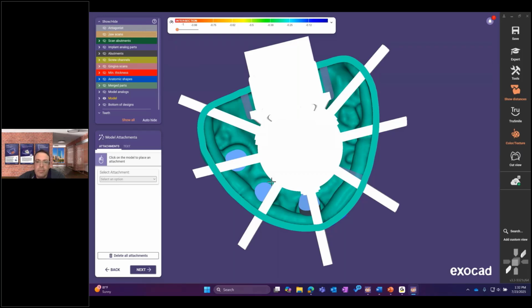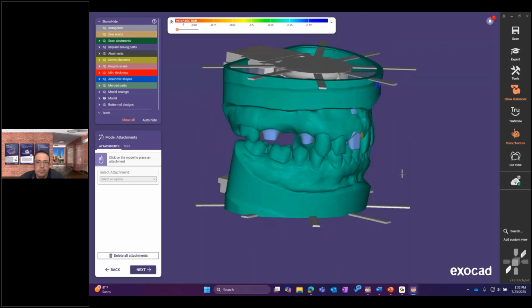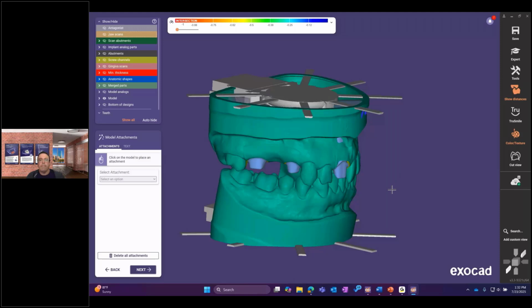And then we got some feedback on some things, and a question about the implant libraries themselves needing updates. So I'll have to follow up on that. I know our integration team's working on updating some stuff on our end. I don't know if the owners, or manufacturers that create the libraries, have any additional tasks on their side as of right now. I've got to double check on that. Yeah, if it's about a specific library, we'll have to follow up.